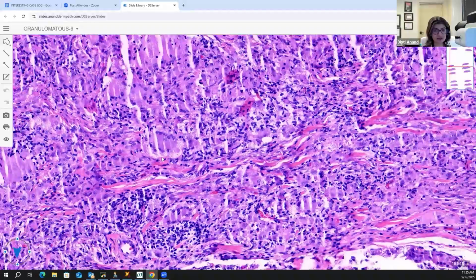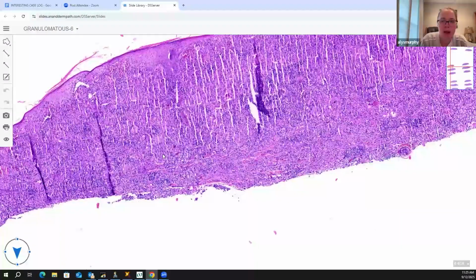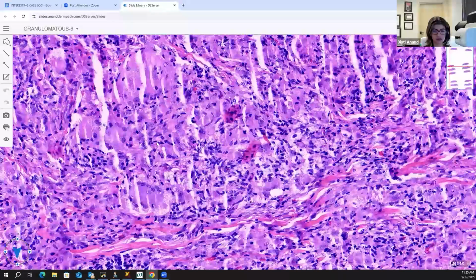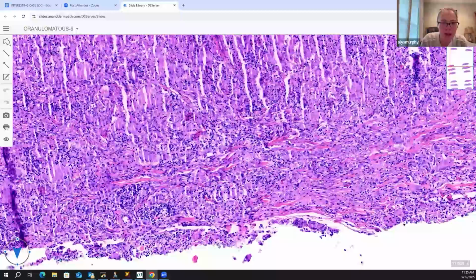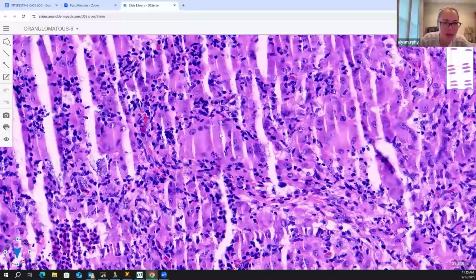Now everybody gets that? I have a question, Dr. Anand. I thought it was a reticulohistiocytoma, because I thought I could see some two-toned cells or cytoplasm. I'm wondering though if that's just artifact. Starting to think it is. Okay, yes.